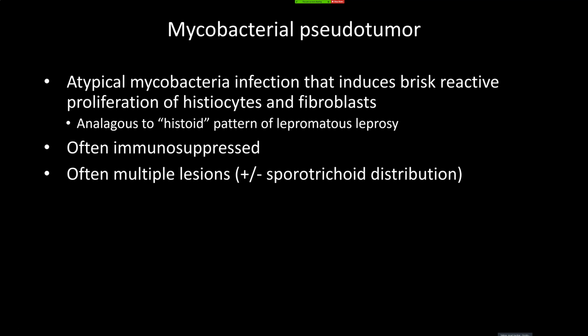So in any case, mycobacterial pseudotumor, kind of analogous to histoid leprosy, and a really dramatic case. I remember seeing a couple of these at meetings in the past and thinking, I will never recognize this in practice. So I'm proud of myself for getting at least this one. And there's another one that I recently showed in another meeting, which I'll have a video on online soon. So I'll have both of the cases I've seen available for review online.